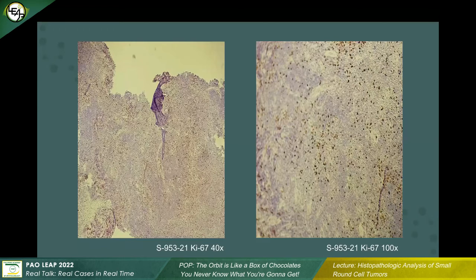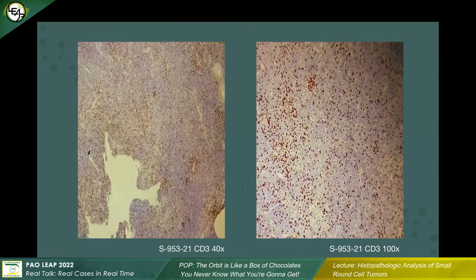As you can see, the tumor cells under investigation did not stain. Wala siyang chromogen. No? And then, here, this is the marker CD3, an immunostain for T-cell lymphoma. Again, it turned out negative. Although marami ka rin nakikitang T-cells, but these ones are not the ones that we are investigating. Siya yung parang blue na yan. Yan yung talagang tumor na hinahanap natin.